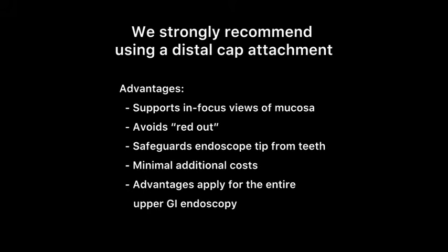We strongly recommend using a distal cap attachment. It supports in-focus views of mucosa, avoids red-out, safeguards the endoscope tip, comes at a very minimal additional cost, and the advantages apply for the entire upper GI endoscopy.